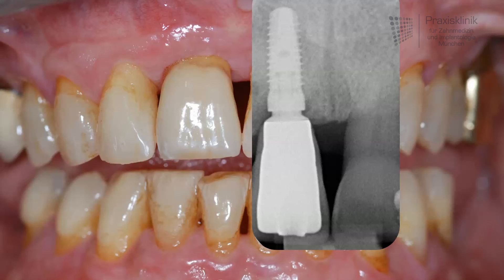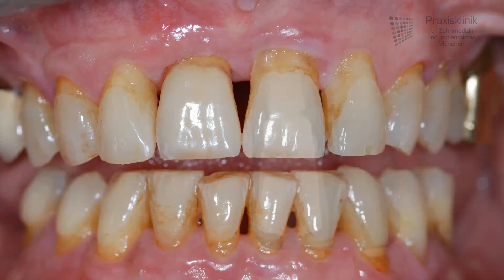And if we have a view without the x-ray image we can see that we have a very aesthetic and very natural result. Thank you very much for your kind attention.